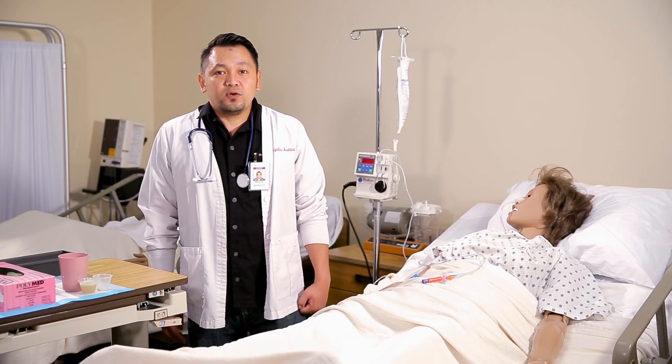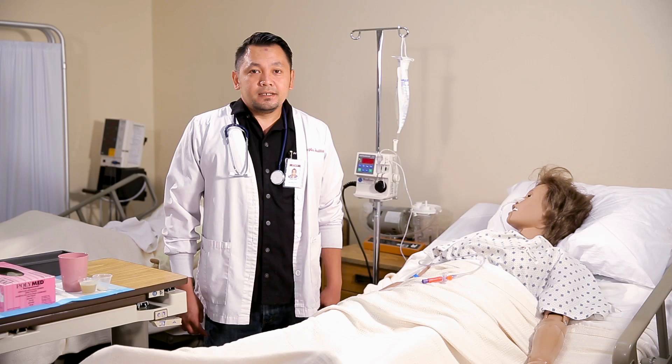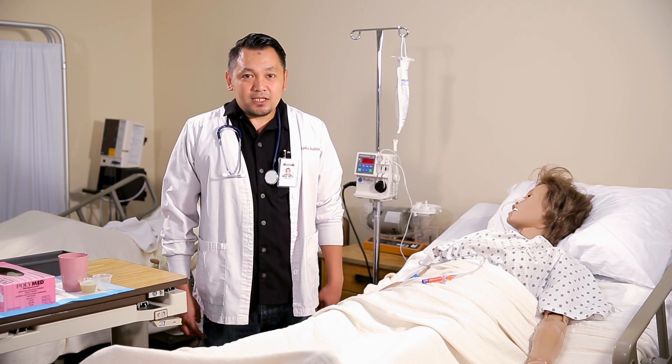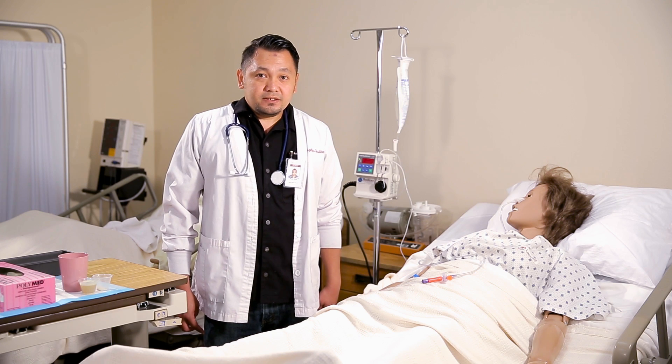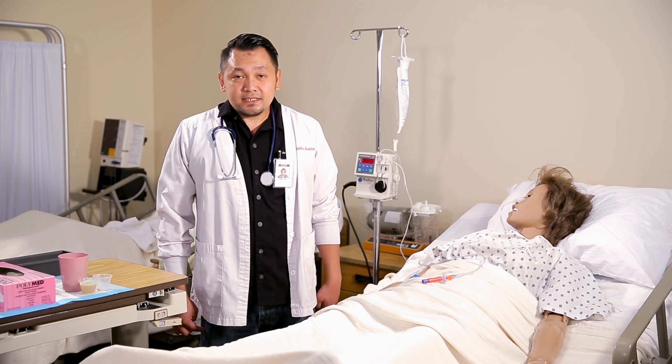First and foremost, we need to check our medication, verifying the time, date, and dosage. Then we need to check our patient's allergy, explain our procedure to our patient, follow the patient's six rights, then follow specific medication directions.